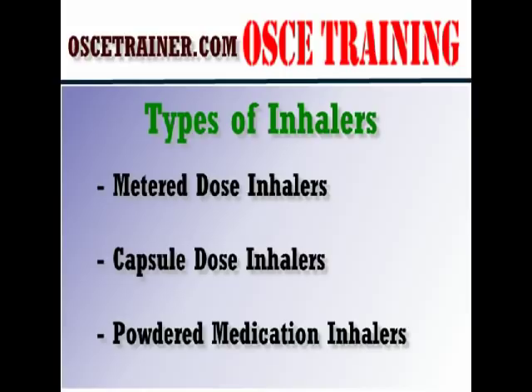You will be given 5 minutes to read the scenario. Read the scenario properly. Look out for education aspects mentioned. Check whether the patient is using inhaled medication for the first time. Check for any diluent medication if mentioned. Inhaled medication device can be of 3 types. They are metered dose inhaler, capsule dose inhaler, and powdered medication inhaler.